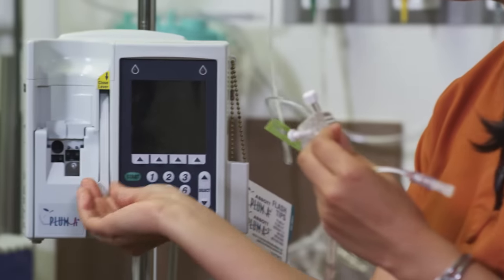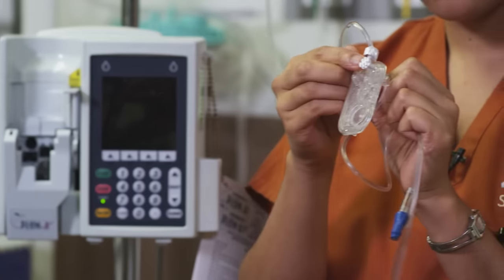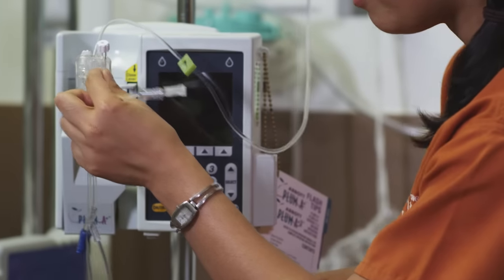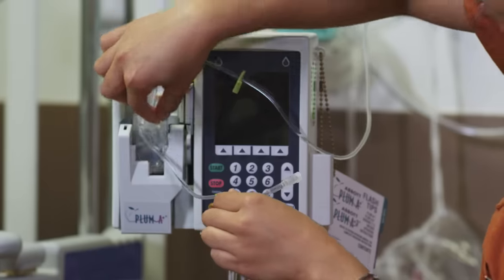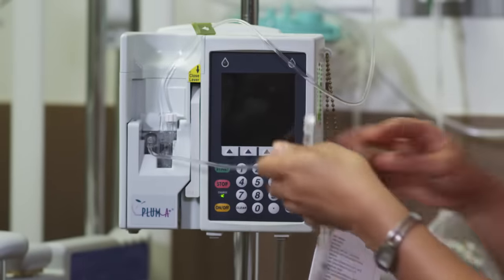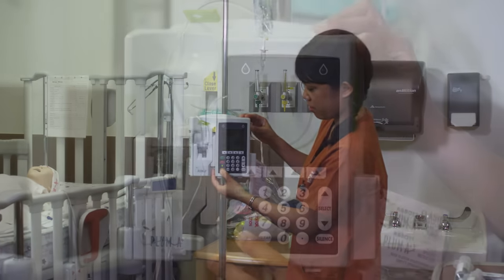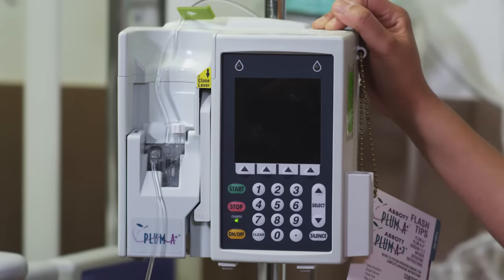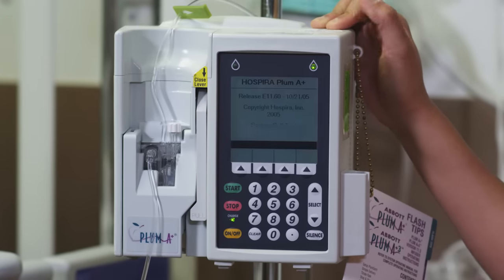So you just pull this up and hold it like this, because your white screw goes right into the hole over there. This just goes in one way — it slides there. Just pull it down. Now we're ready to turn the pump on, and it's going to run through a self-check, so we'll just wait for that.